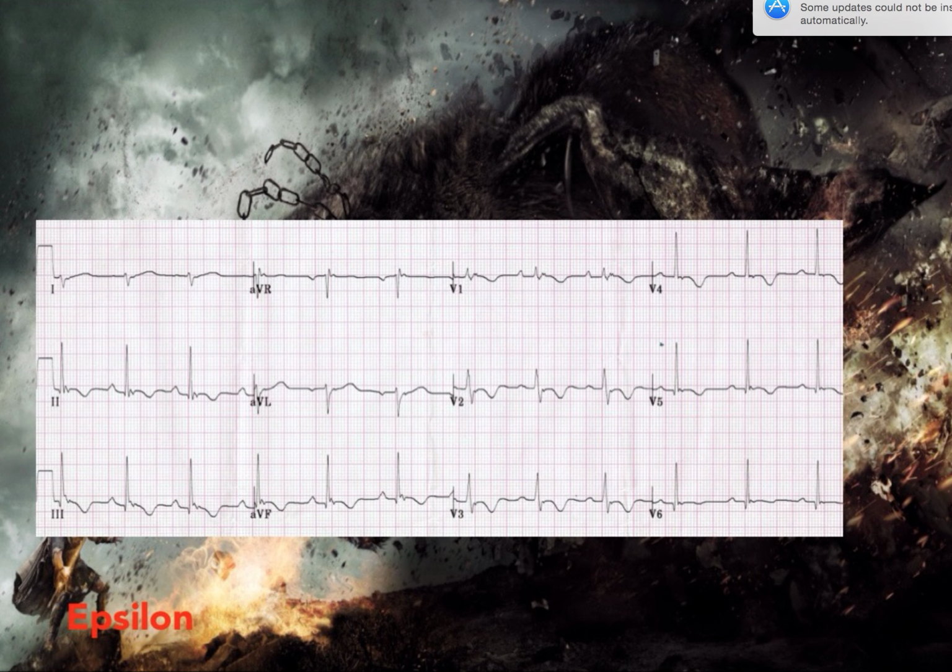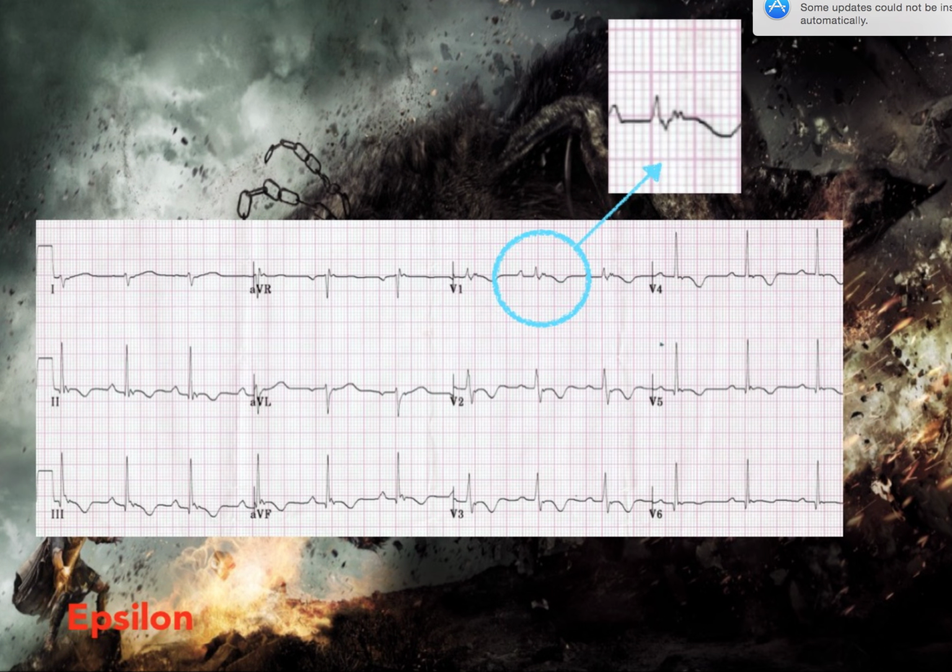But anyway, you look at their EKG and you're like, boy, this is really weird. Something's just not right here. And you can see there are T-wave inversions diffusely. And you think, is this acute coronary syndrome? That'd be a weird presentation in this young, healthy patient. Is this a PE? I know T-wave inversions in the precordial leads can be PE sometimes, but she doesn't have any respiratory symptoms. And then you look closer, and you can potentially pick up this epsilon wave. And epsilon waves are very specific for ARVD.